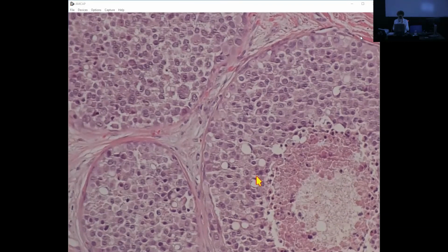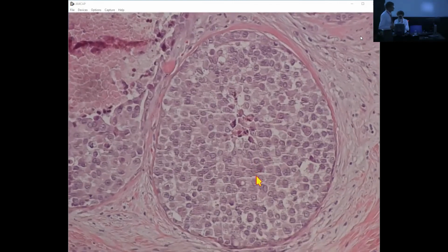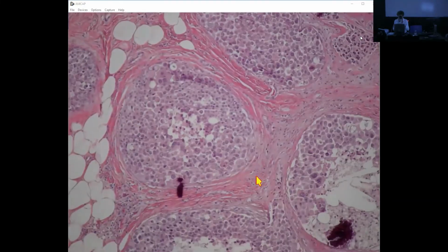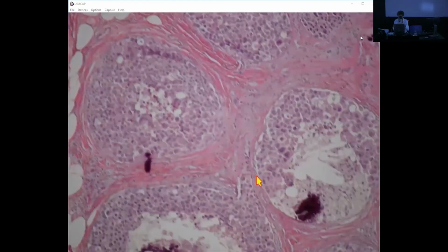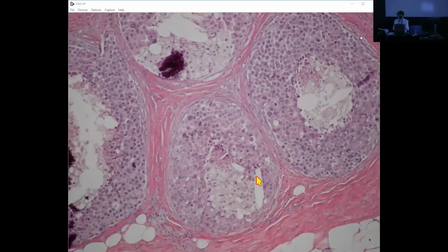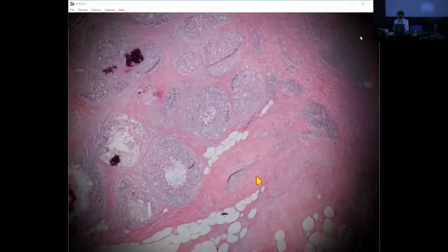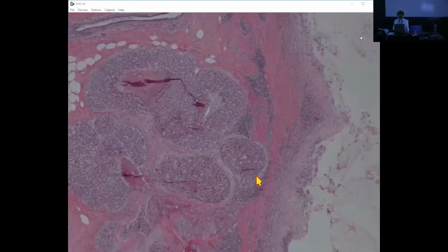We were shocked when they removed LCIS as an in situ lesion from the staging system and stated, oh, it's benign. Well, it doesn't look benign in this particular case. I don't see invasion though in this particular case. I'm trying to find if there is invasion.